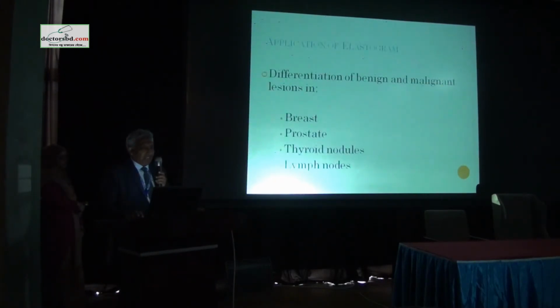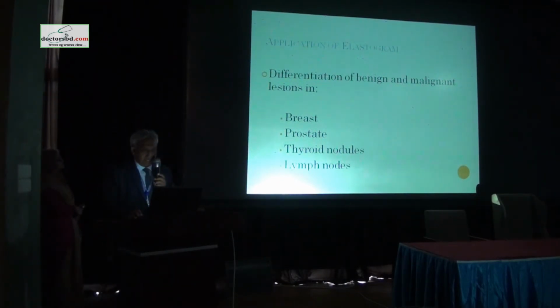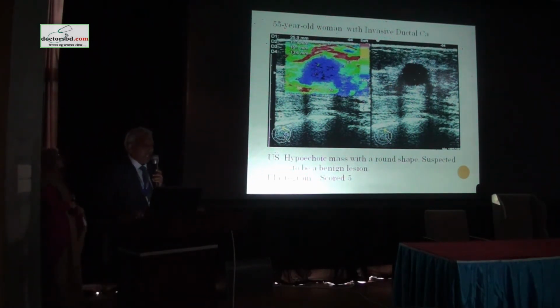And this kind of application is being used in many areas. As you know, elastography is not only used in breast, but in fact in breast, in thyroid nodule, and in the lymph nodes as well. So my topic is basically how elastography is going to help in breast lesions, and that too which are more likely to be a kind of intermediate lesion. Look at this image which represents the assessment on the basis of color elastogram.